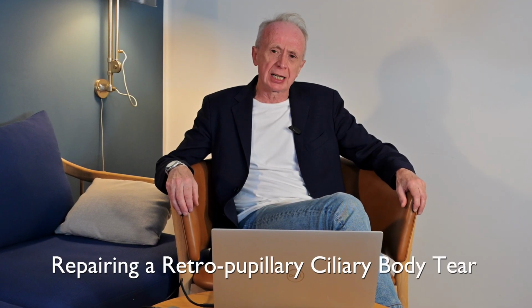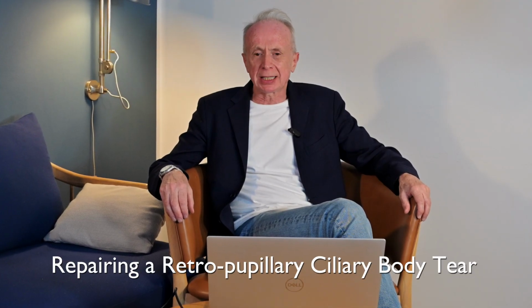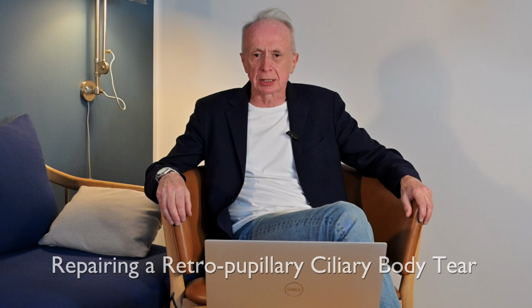Hi, I'm recording this video from the annual Congress of the European Society of Cataract and Refractive Surgeons in Copenhagen in Denmark. Over the years, I've been referred a lot of patients with hypotony, either from trauma, glaucoma surgery, VR surgery, and even chronic uveitis. However, recently I've seen an increasing number of cases associated with secondary sutured intraocular lenses or Yamane-style haptic-fixated intraocular lenses. The case I'm going to present was a particular diagnostic and therapeutic challenge, and I hope you find this interesting.